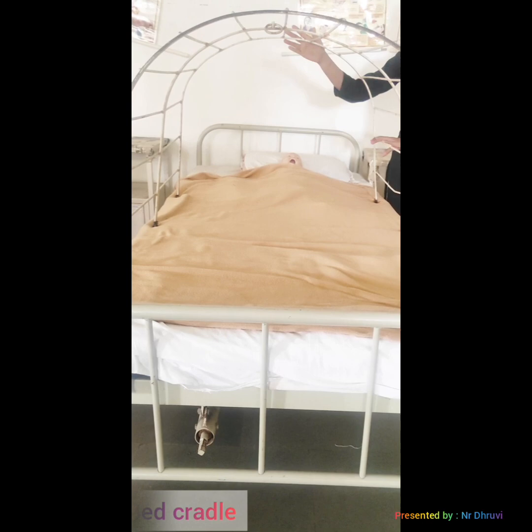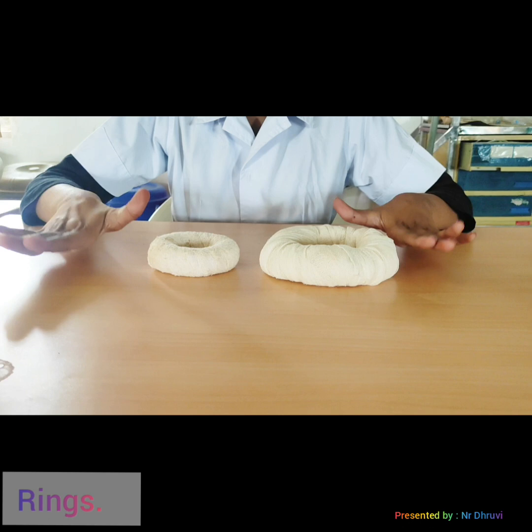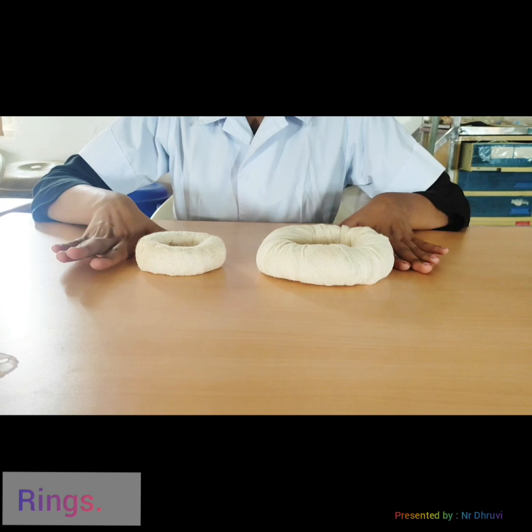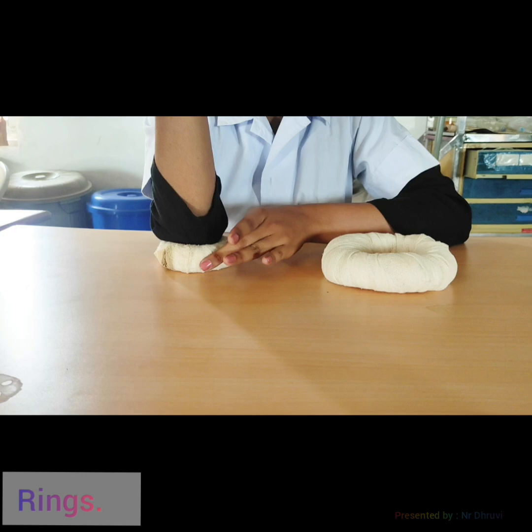The next device is rings. Rings are made up of cotton and rubber material. They are used to relieve pressure on certain parts of the body like the elbow, knees, and occiput. Rings are available in different sizes as per the requirements of certain body parts. For example, this is an elbow ring placed under the patient's elbow to prevent friction. It is used to relieve pressure on certain body parts.